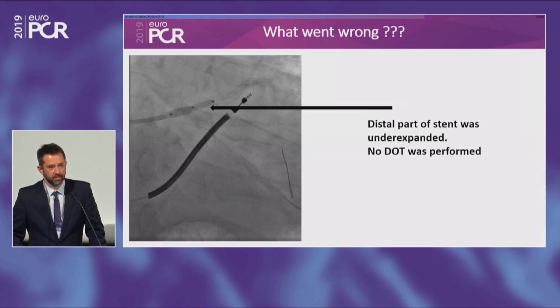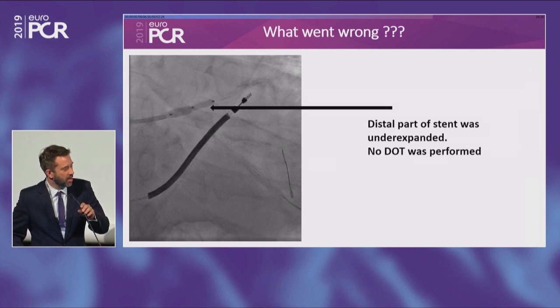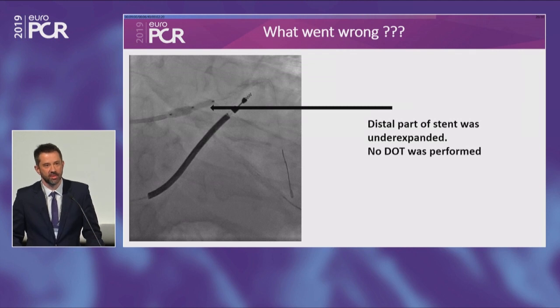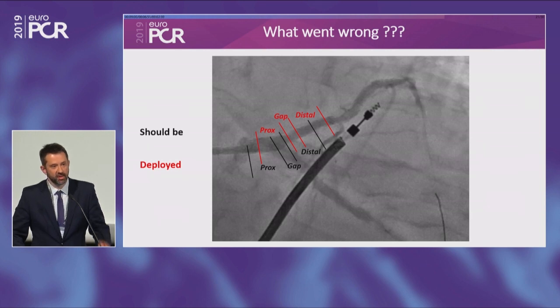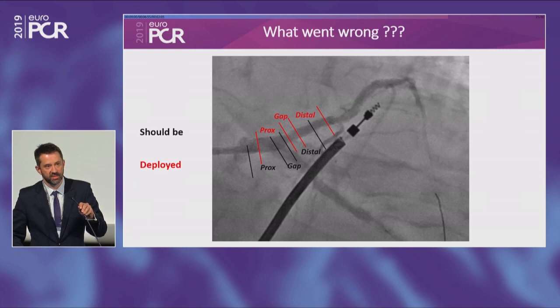And as Professor Serruys previously said, we developed the DOT technique. Polish DOT technique. And now, for most cases, we recommend it and we do this procedure in our lab. So in this case, this DOT was not performed. Just for your visualization, that was the problem with the stent.